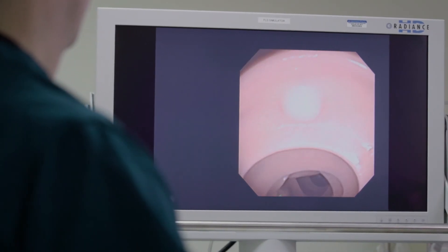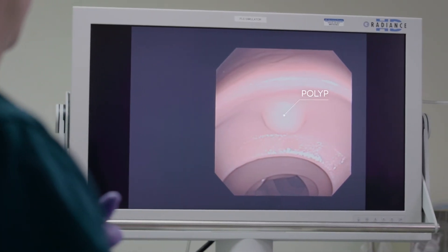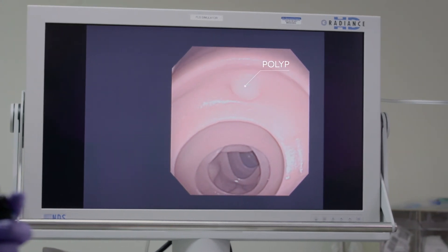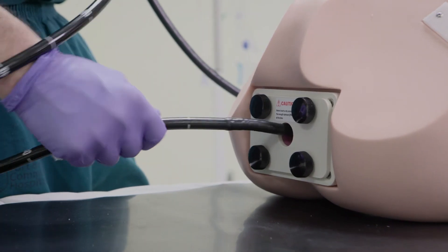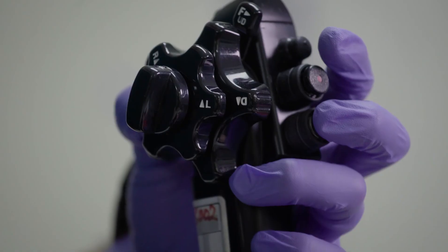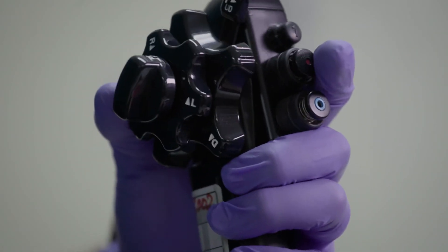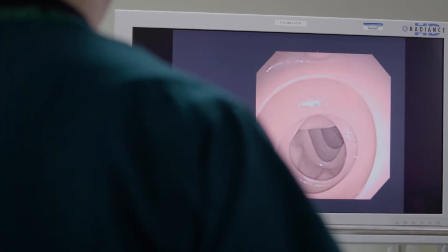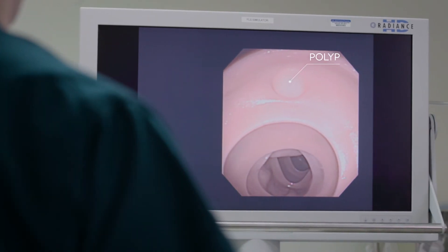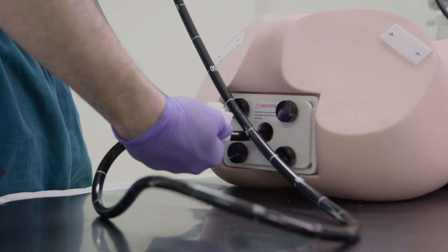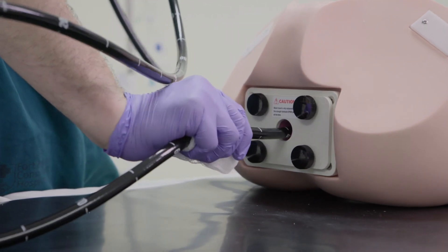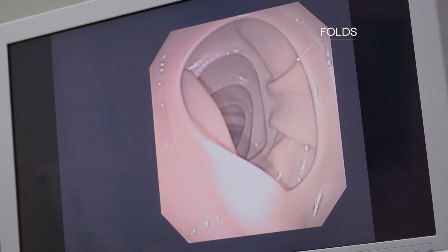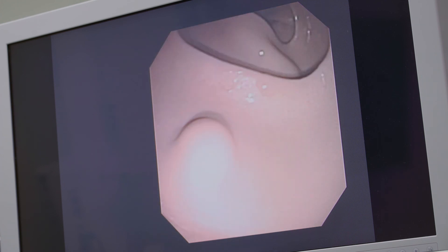The final skill in the anatomic model is inspection of the colonic mucosa to identify polyps. The endoscope is withdrawn from the cecum to the rectum and lumen is systematically evaluated. Insufflation is used to discriminate between polyps and folds, simulating realistic best practice.